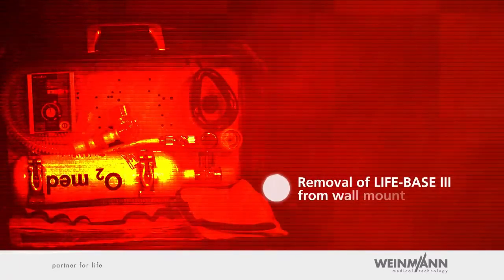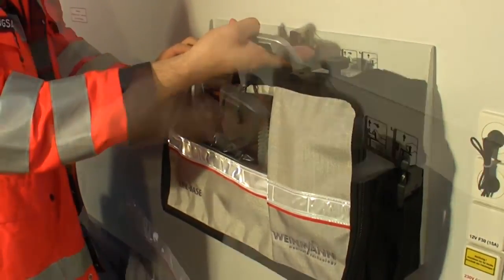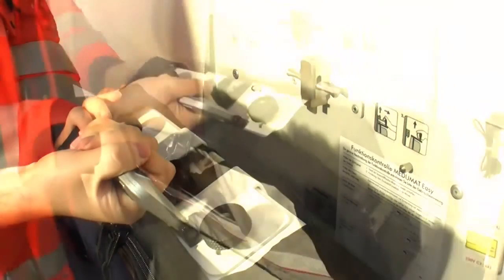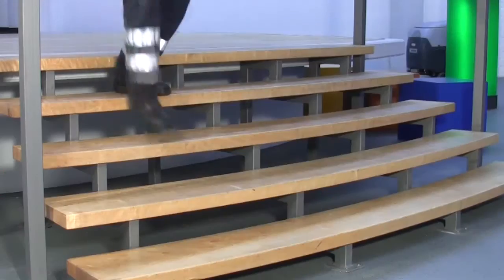Removal of LifeBase 3 from Wallmount. The LifeBase 3 is released from the Wallmount Base Station 3 NG by unlocking the portable system and tipping it slightly away from the wall. The portable system can be easily and comfortably carried by its handle or integrated shoulder strap to any scene of an emergency.